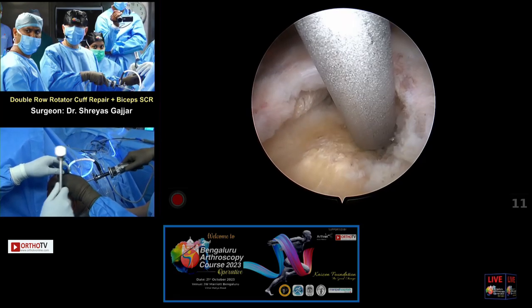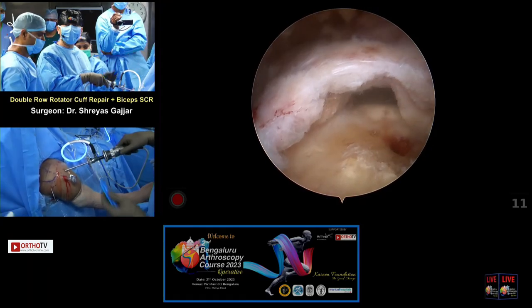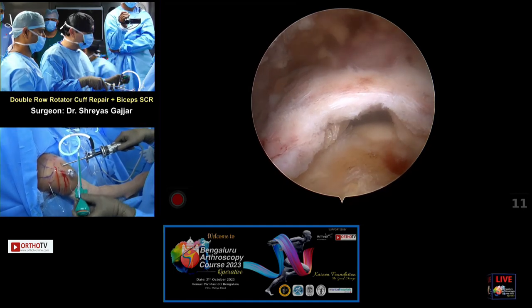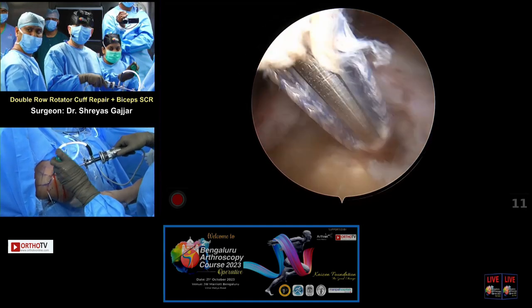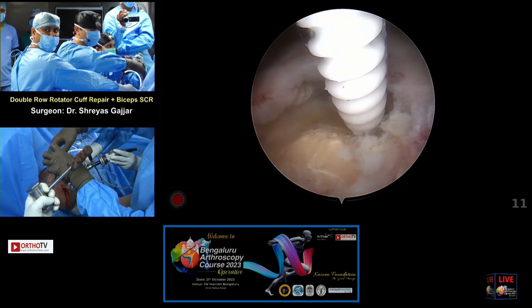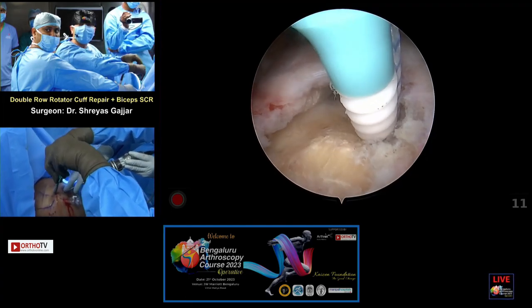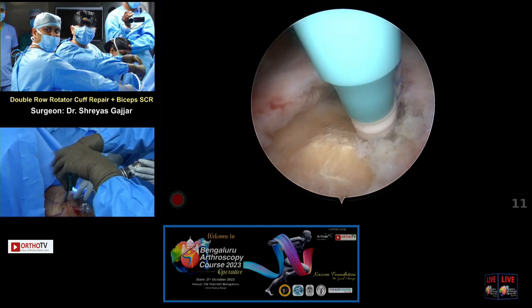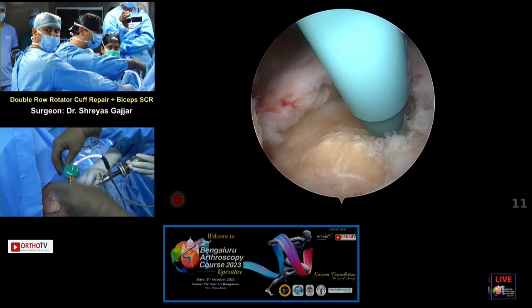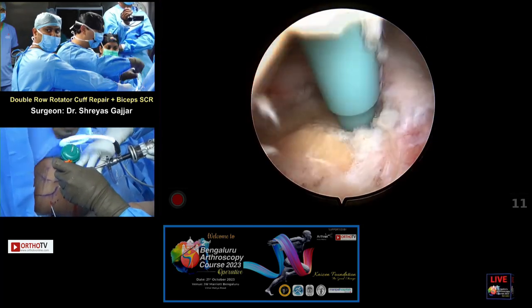Yeah, it is a very low profile hole. For these types of tears, one point is enough. It's not like a massive retracted tear. Now we are passing the second anchor. The screw tip has touched the bone, so I don't need to hammer it. I can directly go in because, as I said, the bone was a little softer compared to the posterior anchor bone. Again, the same steps: make sure that the sleeve is flush, undo the tapes from the thumb pad. If you have the outside image, you can see it again.